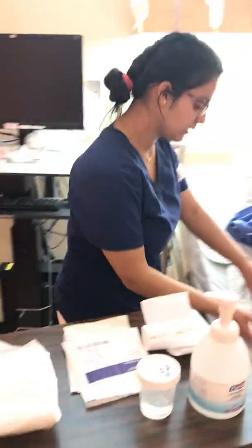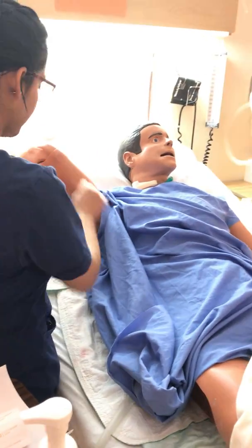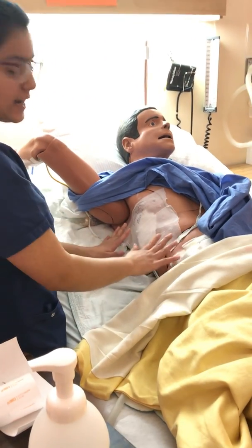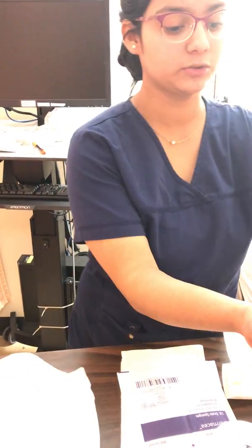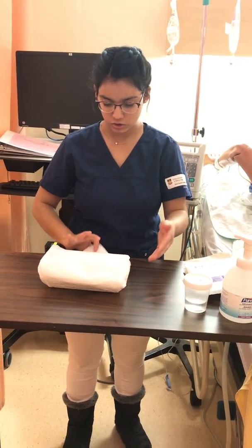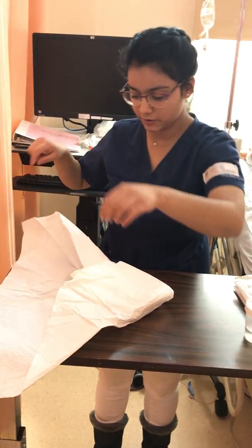I'm going to put her hand in a comfortable position, and we're going to expose the side that we need. I notice there's no subcutaneous emphysema. The site looks good. The dressing is intact. Once I've assessed the site, I'm going to do hand hygiene, and we're going to open our tray. Again, I'm going to make sure that I don't let this go because I want to turn it this way. Now I can let it go.